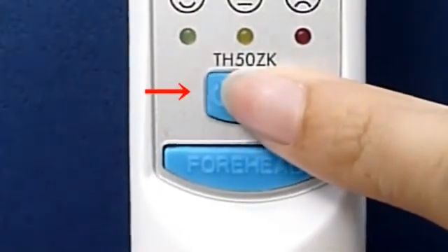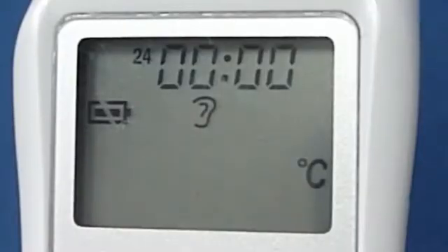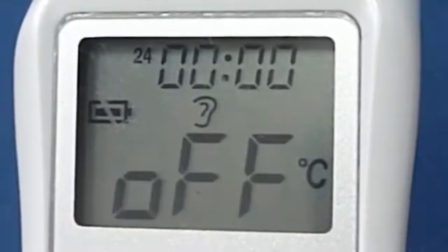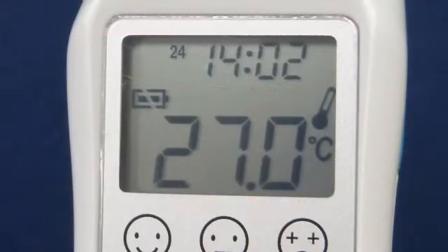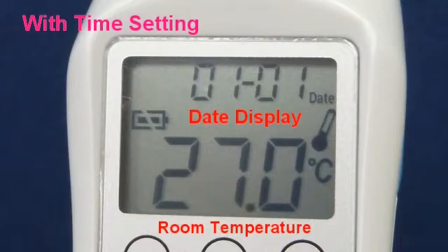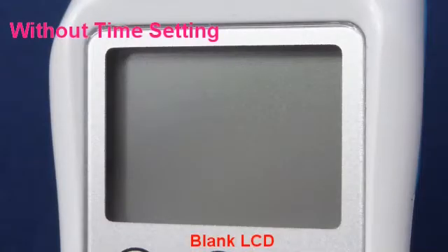Easy time setting: after power off, room temperature will display on the LCD with time setting enabled. Without time setting, the LCD will remain blank.